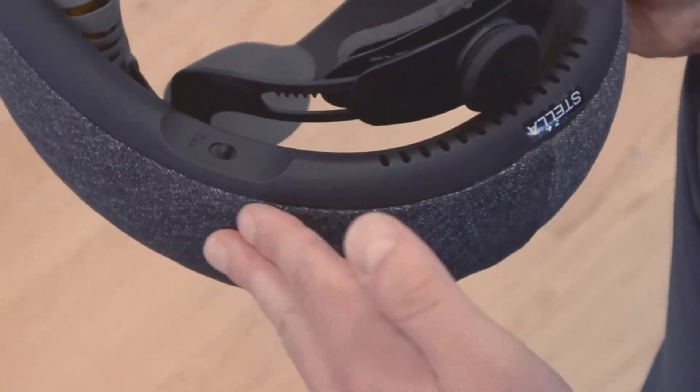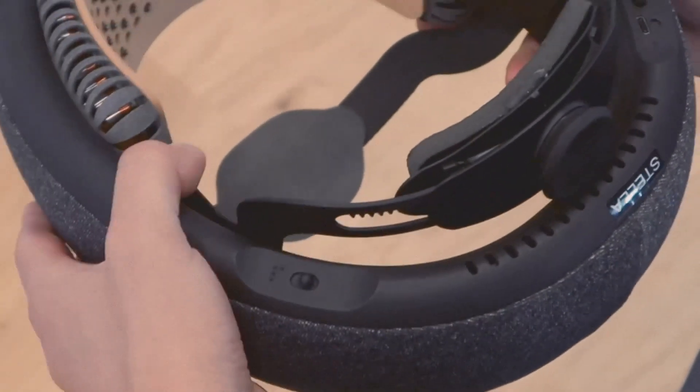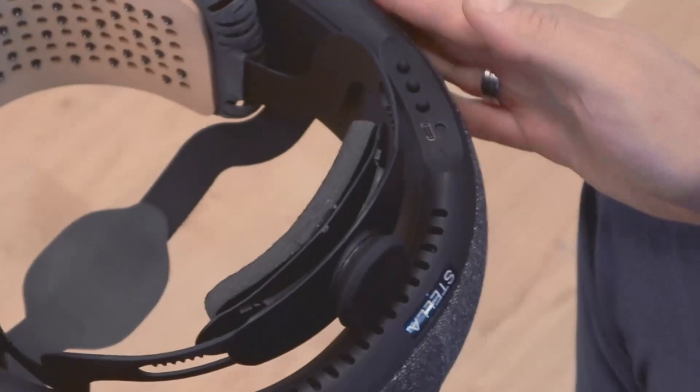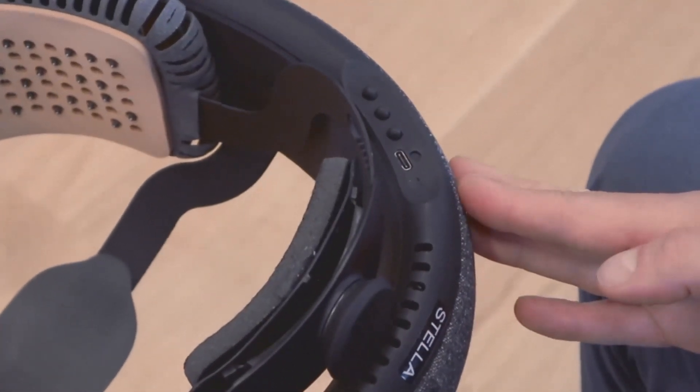SuperBrain has a minimalistic interface. On the left side, you will find the power button marked with Braille as a P. On the right side, you will find three navigation buttons and a USB-C charging socket.